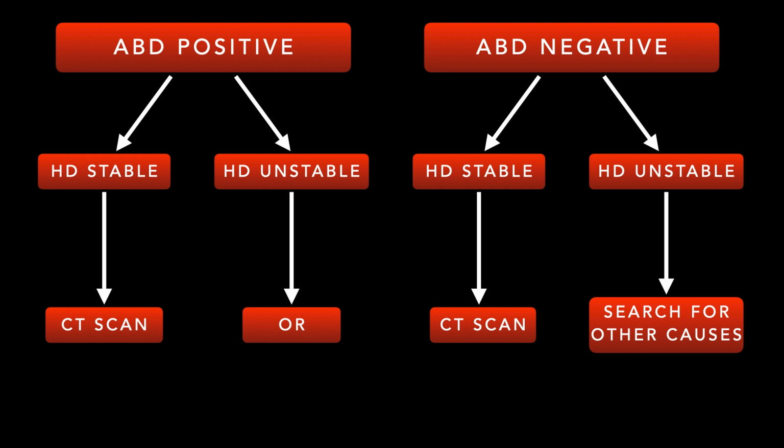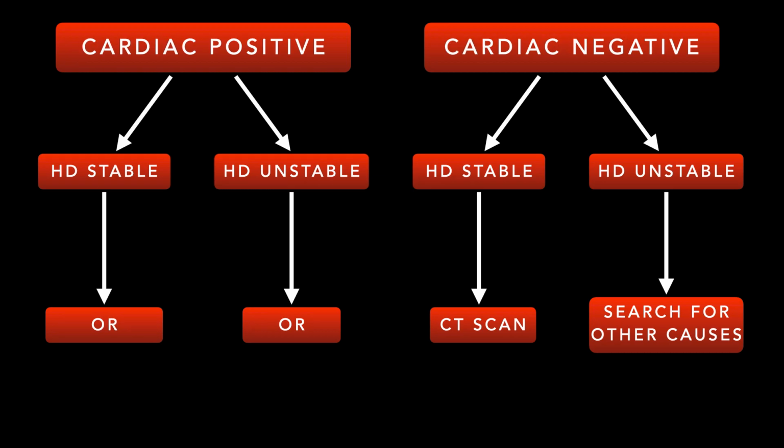And keep a clinical eye out for the patient, right? So with that said, let's move on to the cardiac exam. What do we do with a cardiac exam if it's positive, if it's negative? If we have a positive cardiac FAST in the setting of trauma, and they're hemodynamically stable, the concern is that this fluid is coming from the heart, from the trauma, and that they will rapidly decompensate and become hemodynamically unstable.